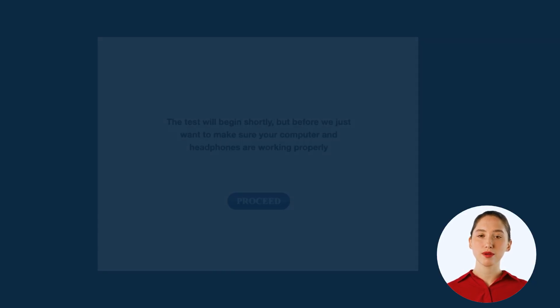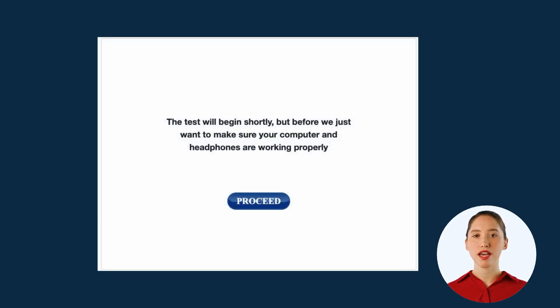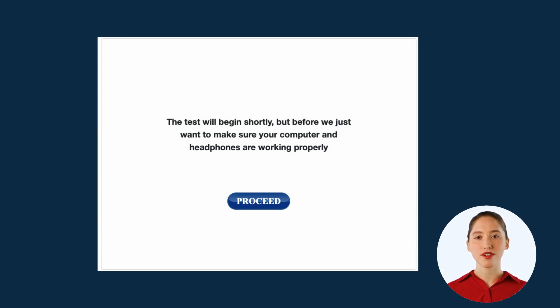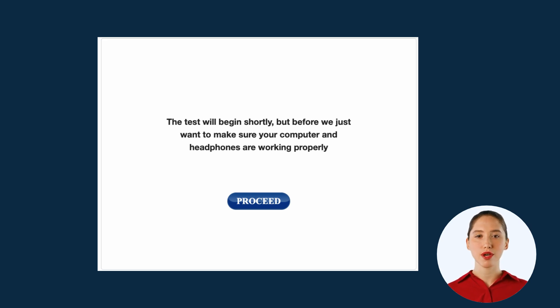Once you or your remote client begin the test, a pop-up will appear announcing that a short check of your computer and speakers will commence once you click proceed. This is done to ensure a smooth MOXO test.